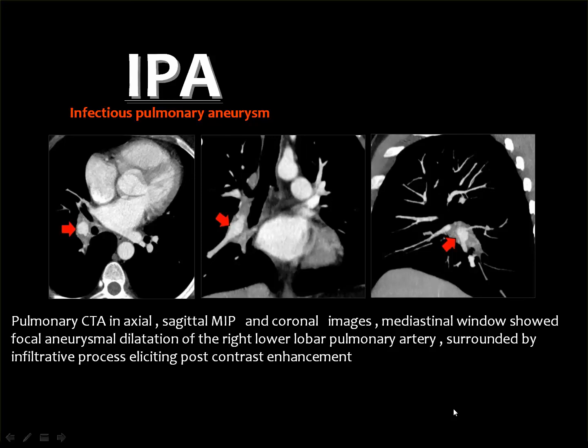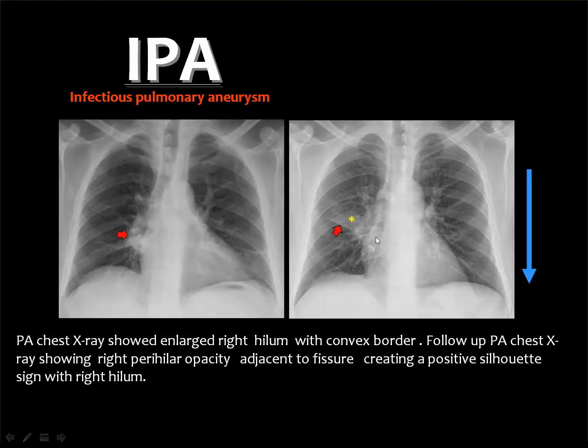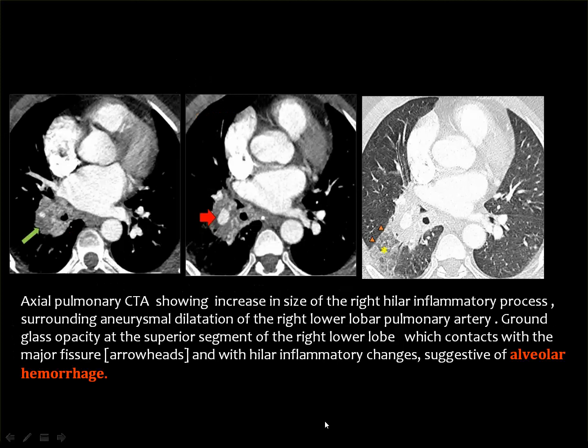Then you remember that I have said, if you discover that the soft tissue of this opacity is including a small aneurysm inside, then you know that the diagnosis is one of two. Either this opacity results from hemorrhage, bleeding from the aneurysm, or this opacity is an inflammatory lung lesion that has weakened the arterial wall, resulting in the aneurysm itself.